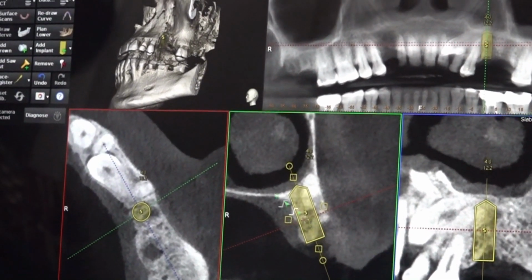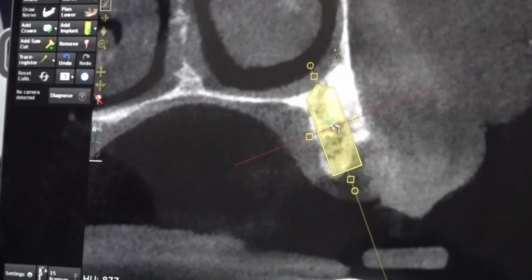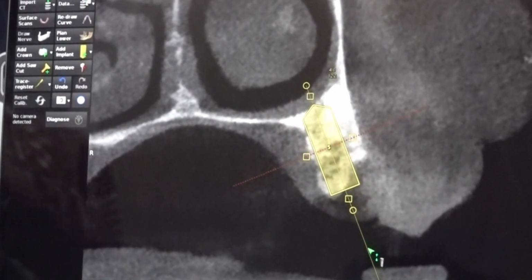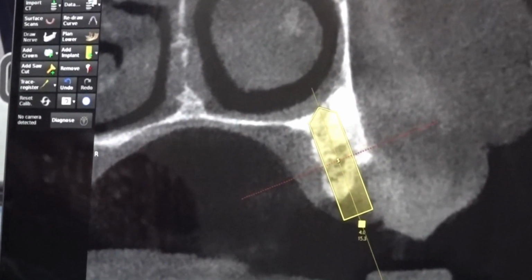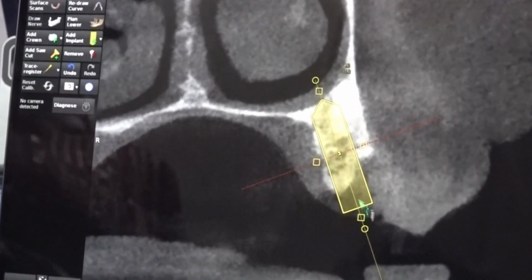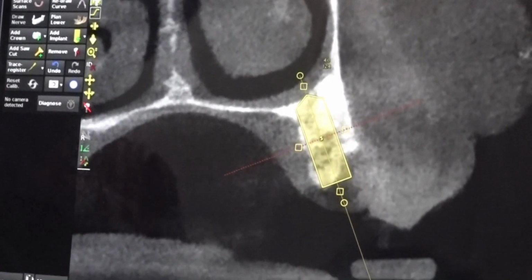You can place even a basal implant, which is also a good choice because the bone quality is good. If you are placing a BCS design, then you have to include the gum also in the length. So it is almost 3.6 by 14 we can place, or if you are placing a compressive, you have to place a 12 mm implant.